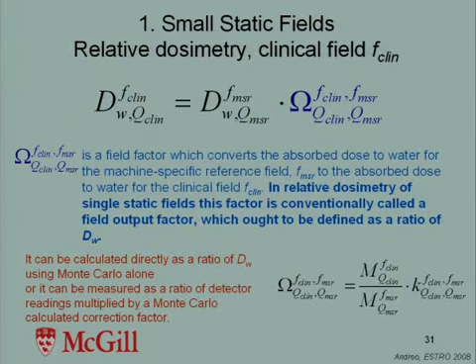The formalism goes one step further, and it defines a form of an output factor to go from the MSR field, which is just one standard field on your machine, to any other field that the machine can give you. And you're allowed to measure that output factor, or the protocol will guide you how to use correction factors that are listed, in trying to realize this kind of output factor.